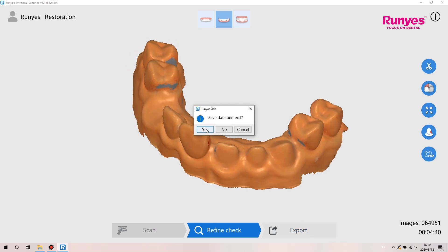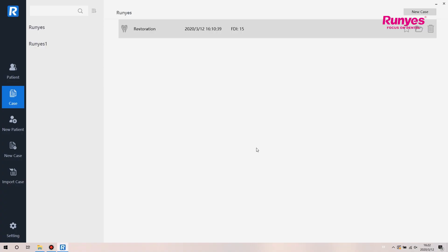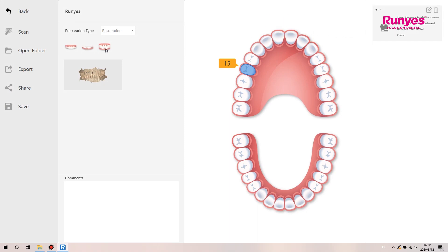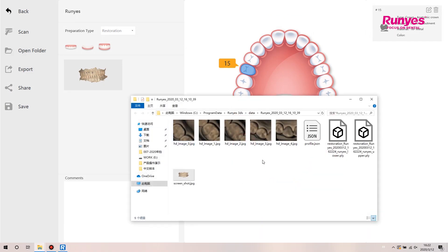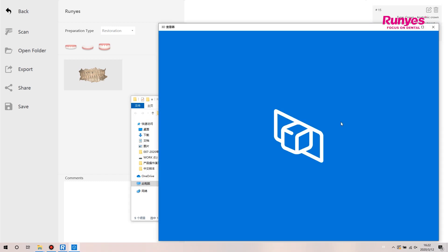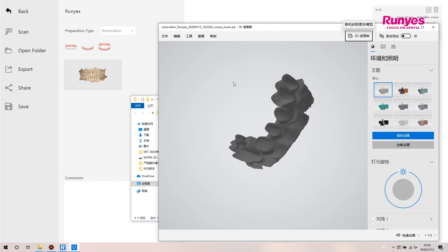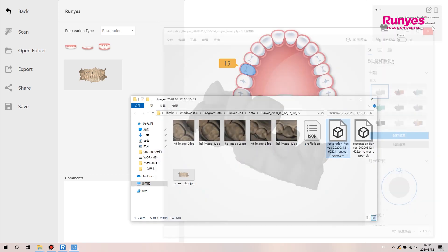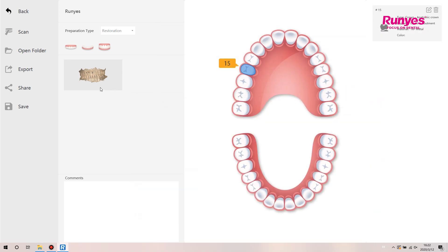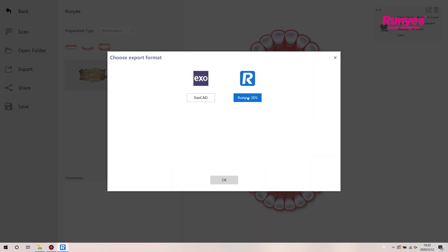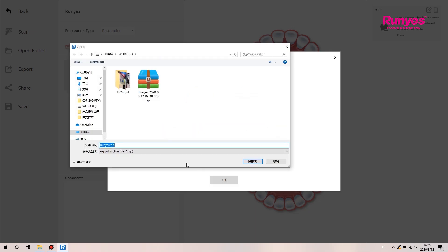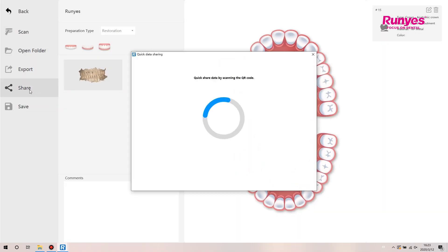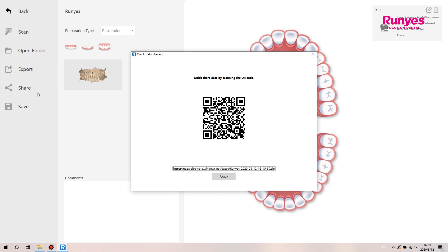After the refine check is completed, click exit and save the data. Click the case button to open the previous case, and click open folder to open the case folder. The HD photos are also saved in the folder. Click the export button — users can choose to export to Exocad or Runyes file format. Note that if users need to export to Exocad, they must select the tooth number to be restored when creating a new case. Click the share button — the software will automatically generate a QR code and download link for the case. You can send the QR code or the link to the lab to download the file.